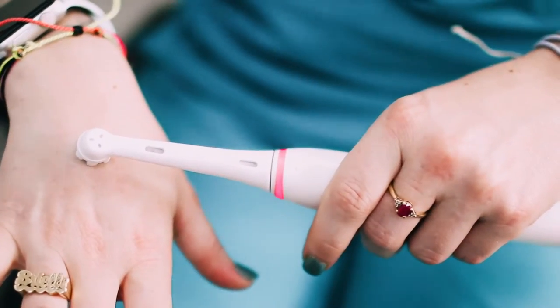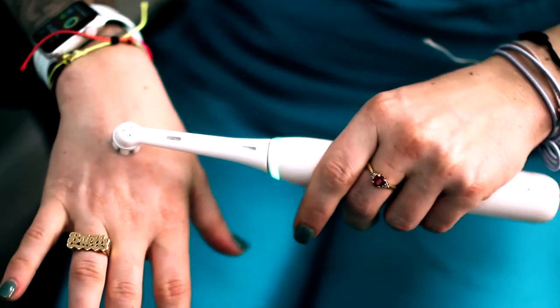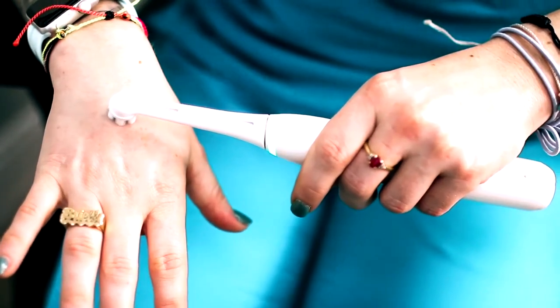On top of that, a lot of them now have pressure sensors. If you look at this light, it's actually indicating how much pressure you're using. If you put it up to your hand and you're brushing too hard, it turns red — which can also cause recession. If you're brushing at the right pressure, it turns green. So that's how you know you're brushing at the right pressure, which will prevent any type of recession or abfraction or anything like that going on in your mouth.